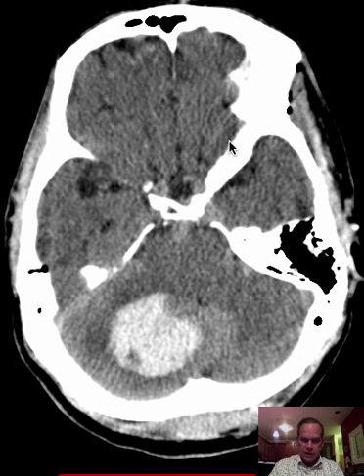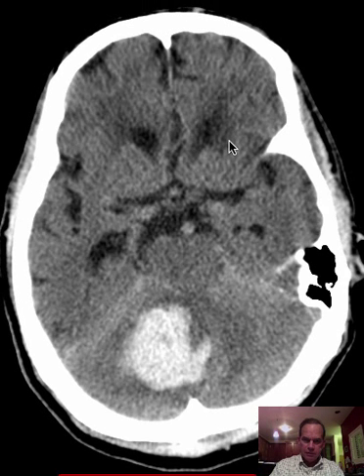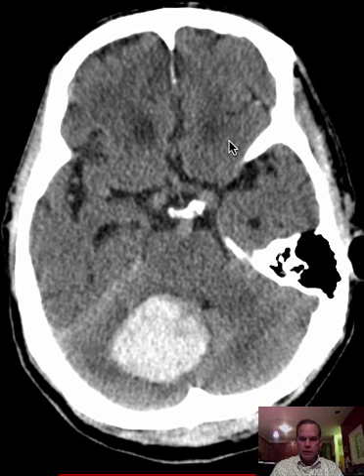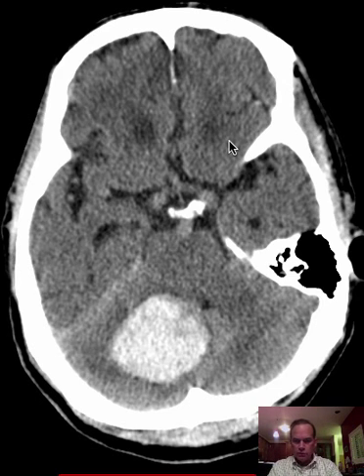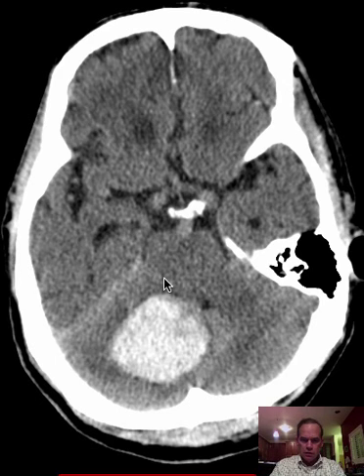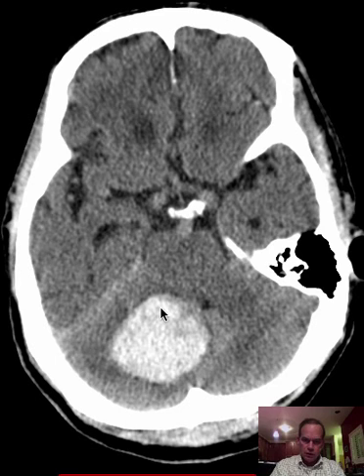Now let's see how we're going to describe the abnormality. Remember, you want to have a succinct but accurate statement, and then maybe a second or third succinct and accurate statement after that. I would say that there is a large hemorrhage in the right cerebellar hemisphere. That's a certainty — we can say that for sure.